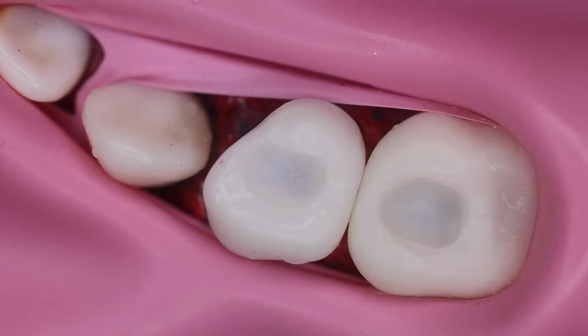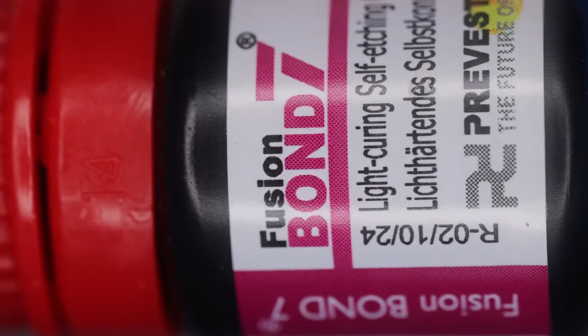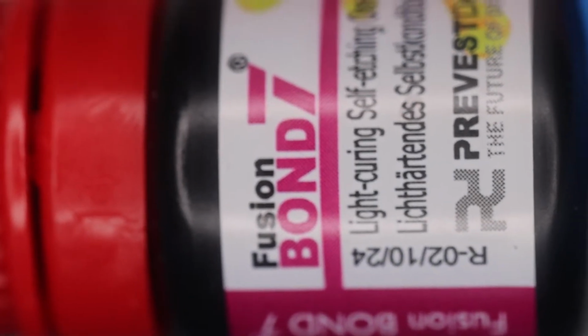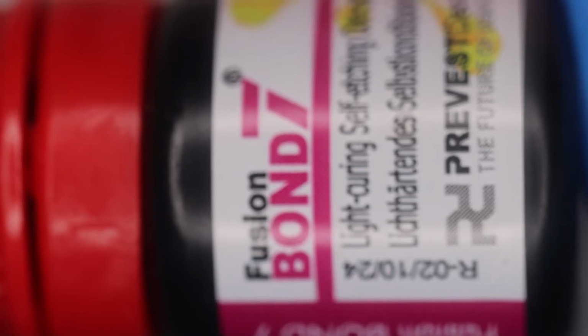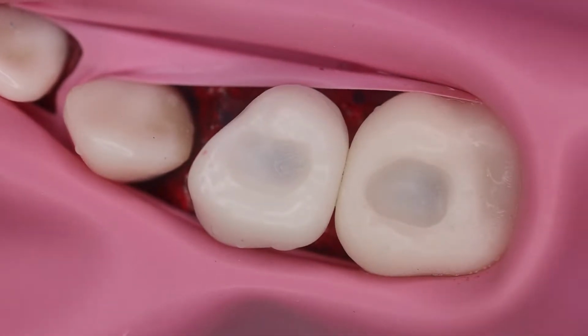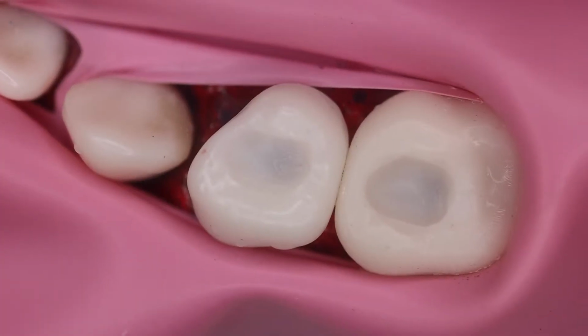This is a 7th generation bonding agent, Fusion Bond 7 from Prevest. We are using this one as we don't require an etchant, and this is a light curing self-etching bonding adhesive.